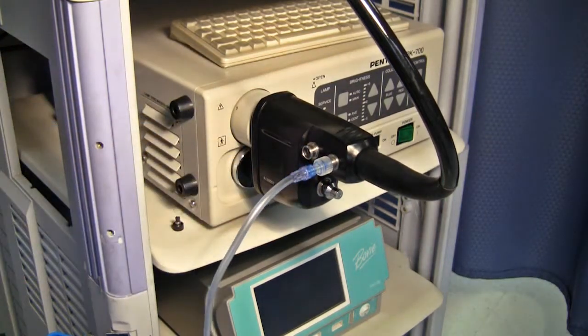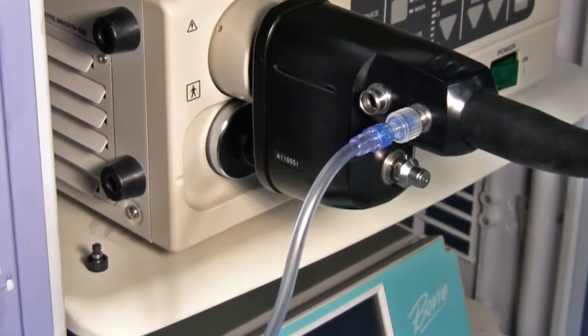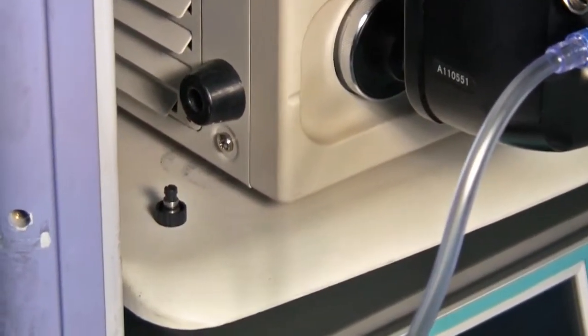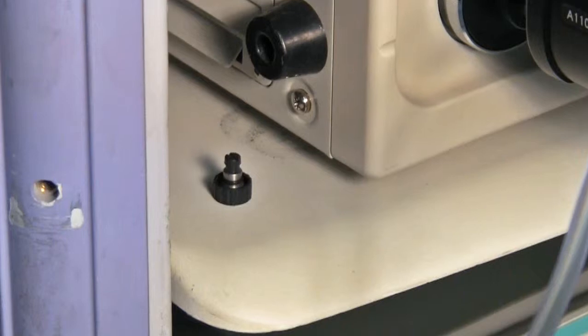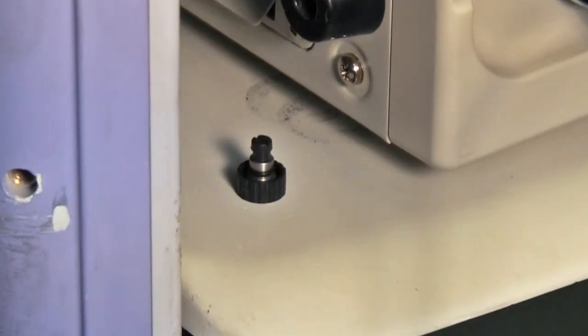You can see the endogator tubing connected to the Pentax reusable adapter placed to the side next to the processor. A portion of this component was incorporated into the design of our single-use connector, essentially combining two pieces into one. One note regarding the Pentax jet connector: although the Burn Medical connector will replace this connector for clinical use, do not discard it completely. To properly reprocess the Pentax scopes, the Pentax connector is required to appropriately connect to an AER when reprocessing.